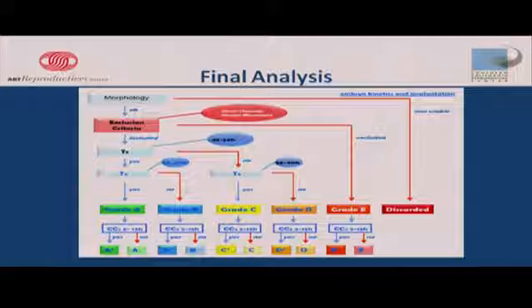And then in this case, we can use times that the embryo reached certain stages, either the 2 cell or the 5 cell stage. And if they reached it within the window that is most optimal and that is shown to us by known babies produced, we know it's a better embryo than another, and we can rank it a much higher embryo.